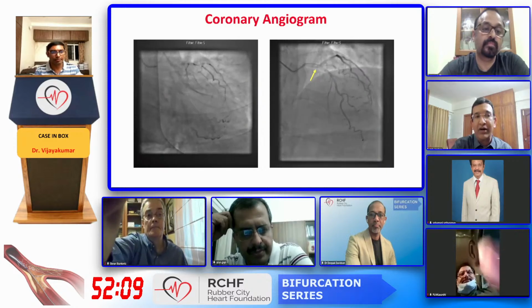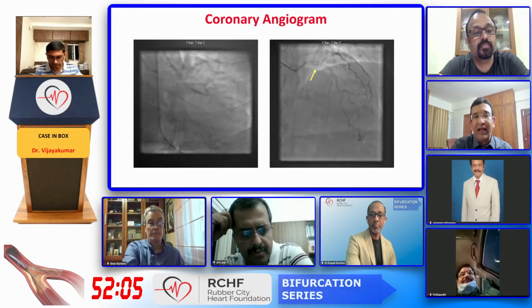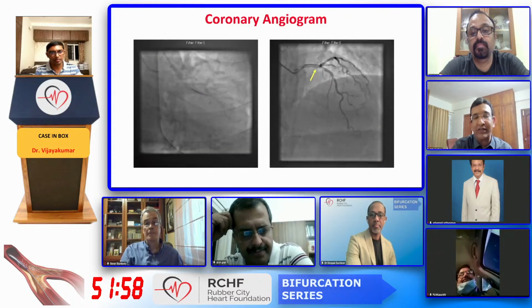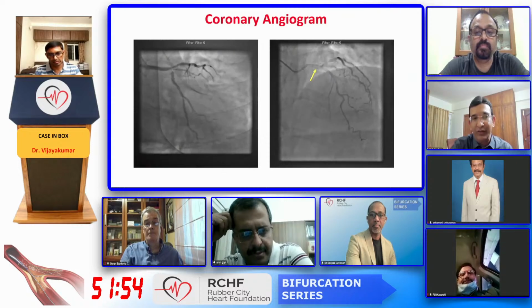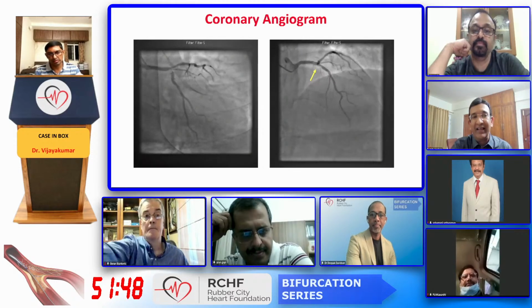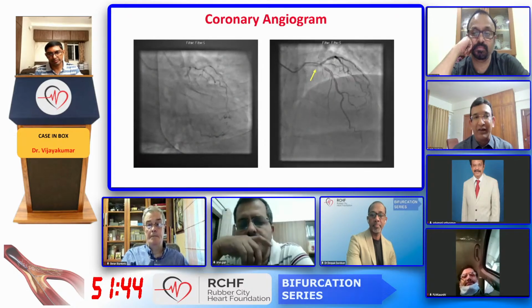Because if you have to stent from left main to circumflex here, that will definitely affect the LAD. So if the LAD is ischemic to start with, then you are much more justified in doing the case. On the other hand, if LAD is not ischemic initially, then the question would be, it's ostial circ.